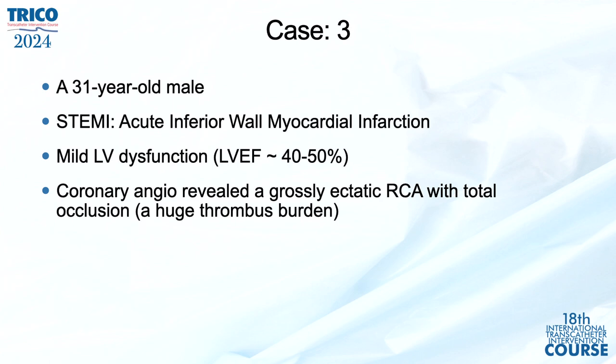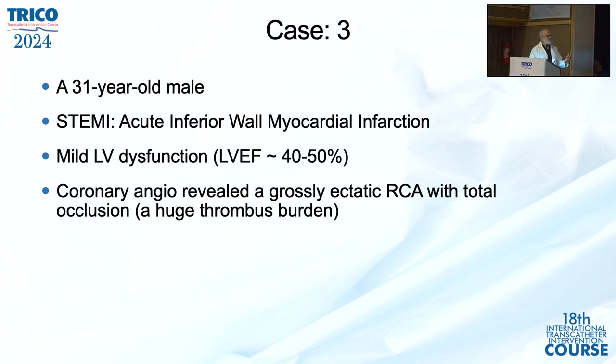And what happens is, in aneurysm, sometimes if there is a short segment left within a stent, significantly covering the normal segments proximal and distally, I don't think you have to chase and go on dilating. Otherwise, if you crack the stent, if you create stent fracture, it is 100% restenosis setting.